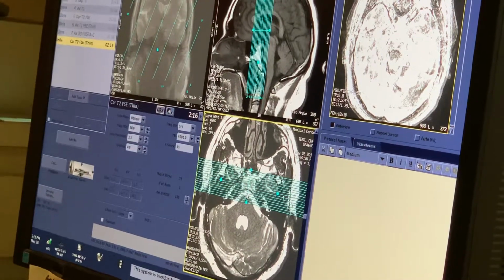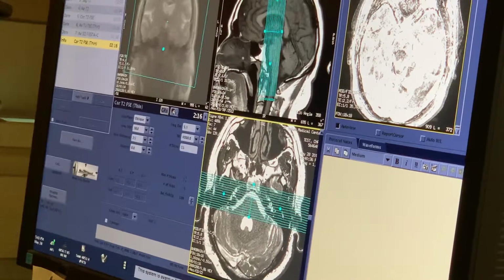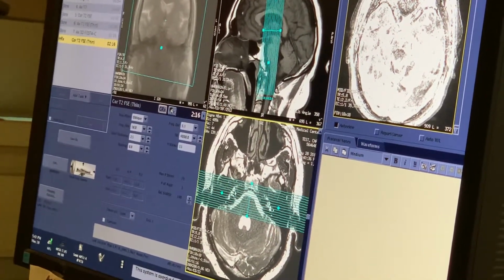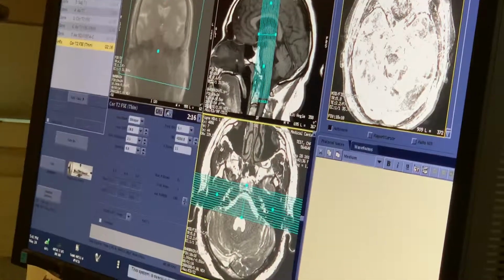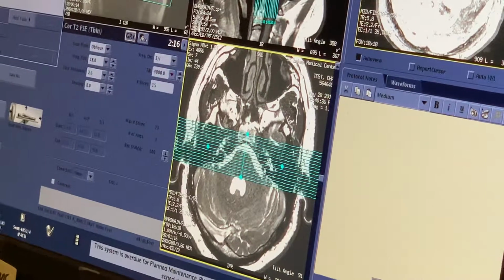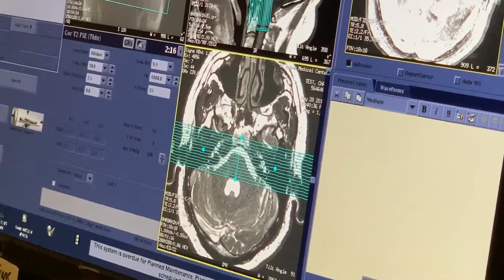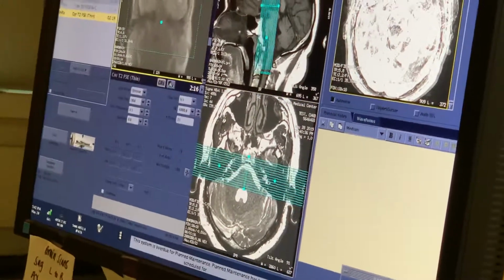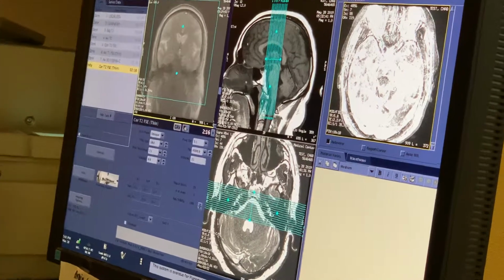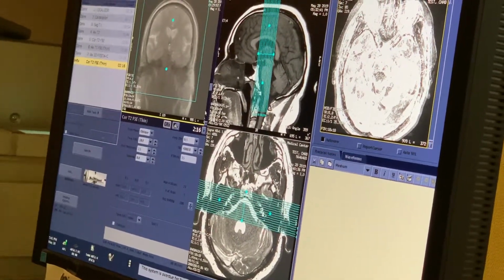They're never symmetrical. I've heard them referred to as Shrek ears or whatever. They're always different, with slightly different angles and directions. You just want to match them as best you can. There's no art to it. It's just angle until you think that they're symmetrical side to side like that. Okay? I'm going to re-angle this just a little bit like that. And that looks good. So I've got the IACs covered. And again, my slices are going from anterior to posterior.